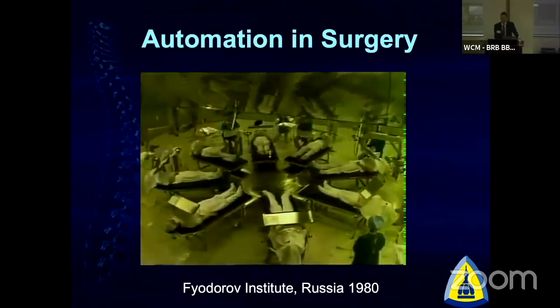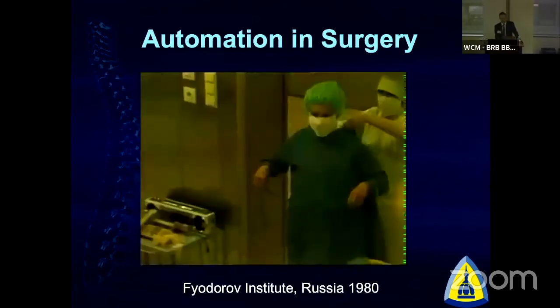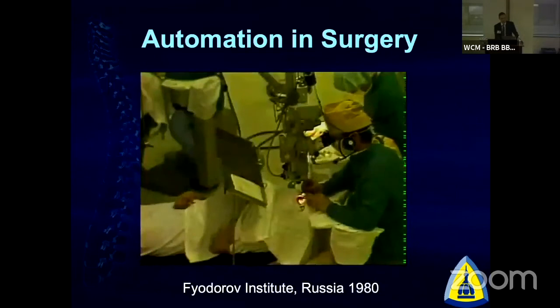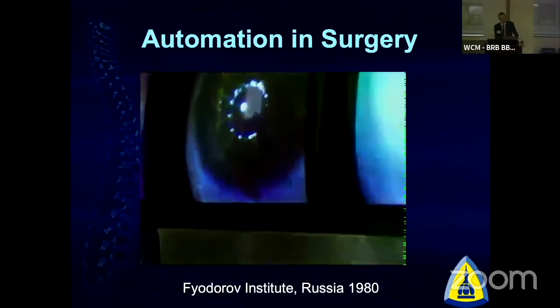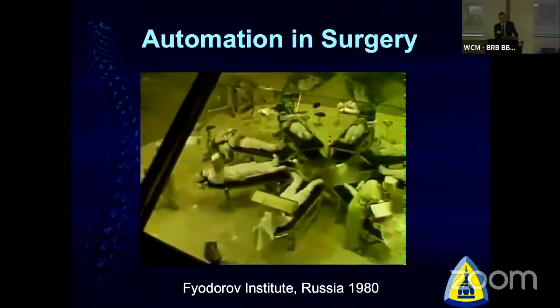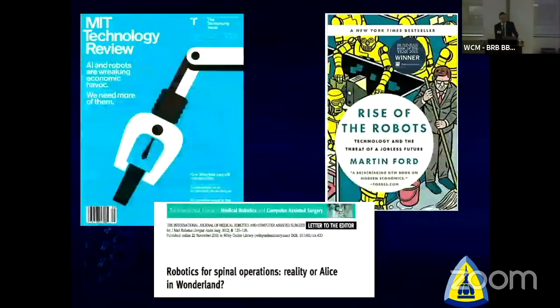I don't think we're ever going to get to this point in spine surgery, but it's certainly an interesting concept where these patients are brought to the surgeon and basically the surgeon stays in the same place, and the patient is prepared, anesthetized, certainly not under general, but then just moves over one slot for the surgeon to do the case. So both in technology and in pop culture, this trend in robotics is coming to fruition.